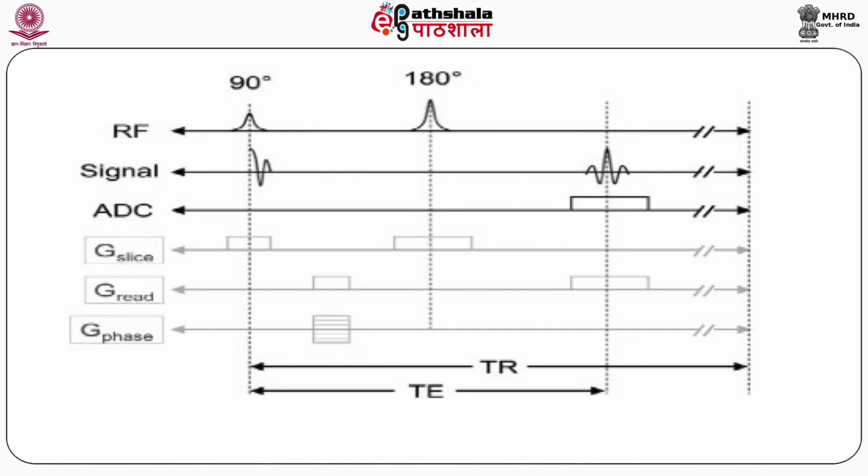You can see the pulse sequence. A 90 degree RF pulse is first applied, then a 180 degree RF pulse is applied.